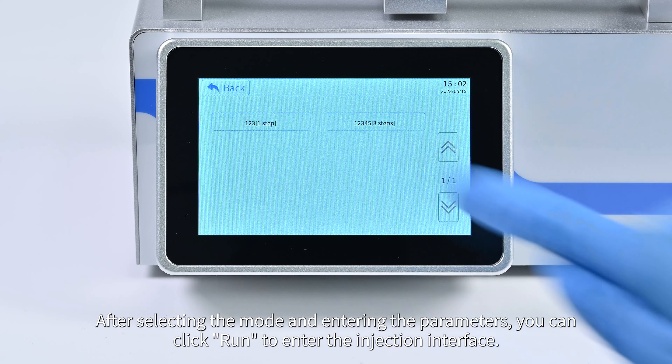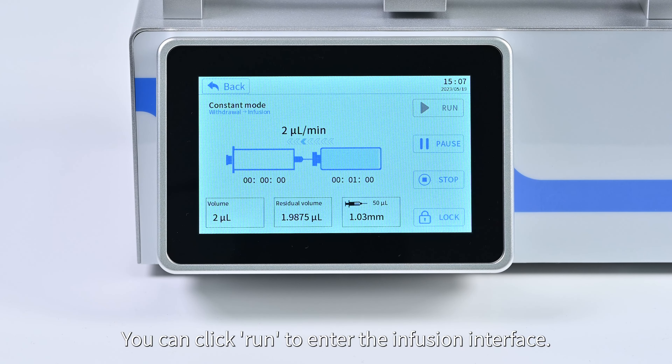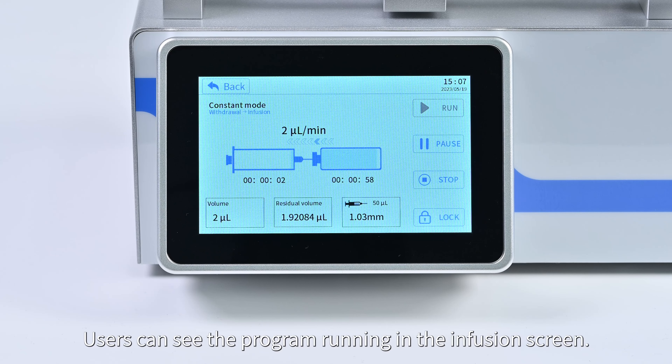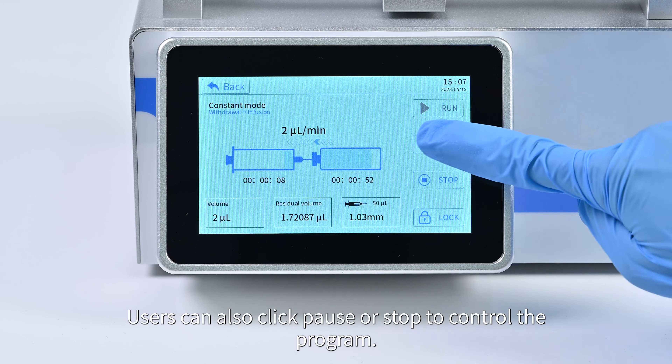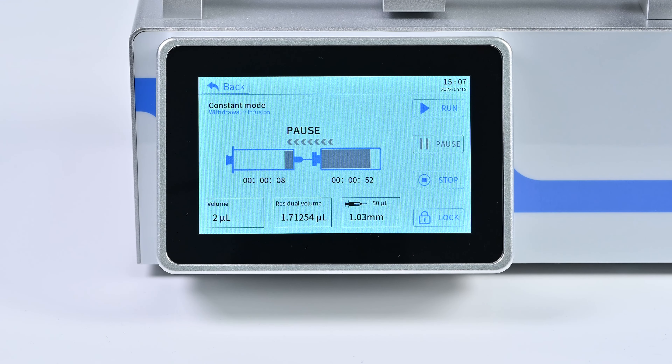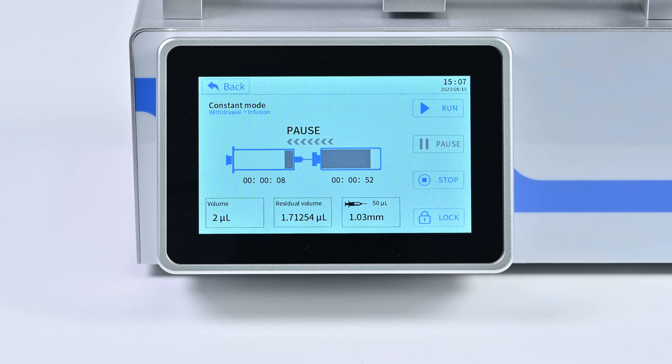After selecting the mode and entering the parameters, click 'Run' to enter the infusion interface. Users can see the program running in the infusion screen. Users can also click 'Pause' or 'Stop' to control the program. Click 'Lock Screen' to prevent accidental touch.